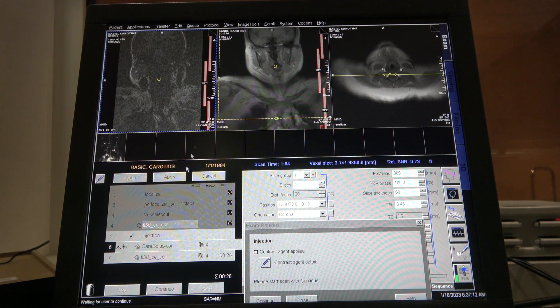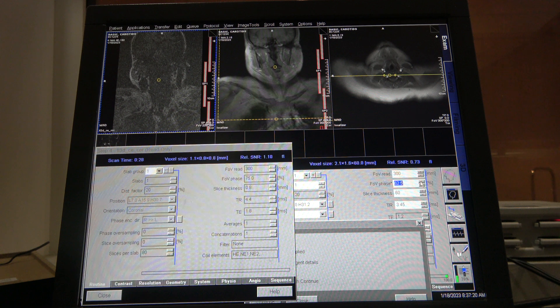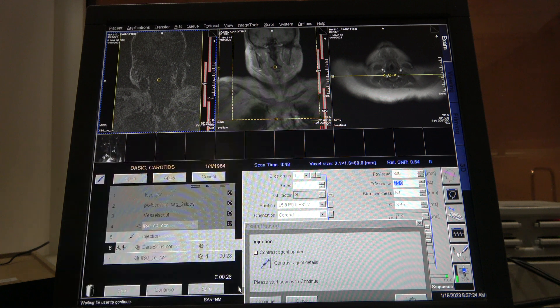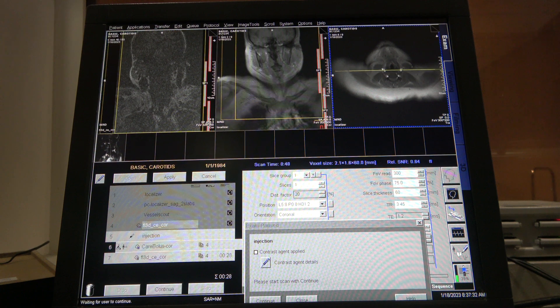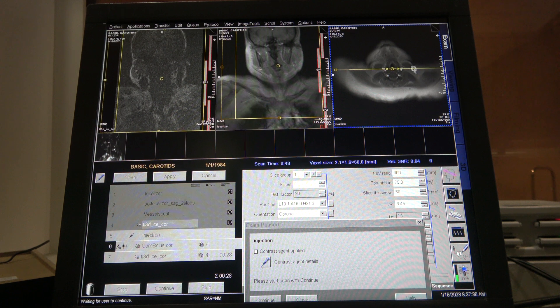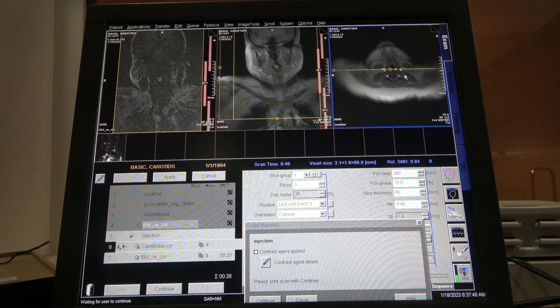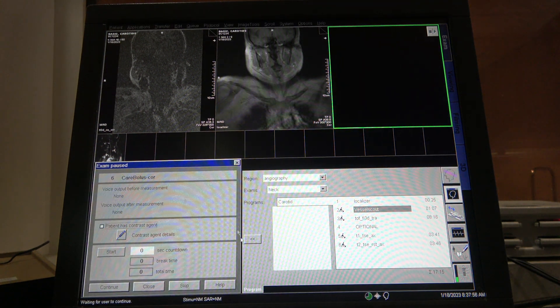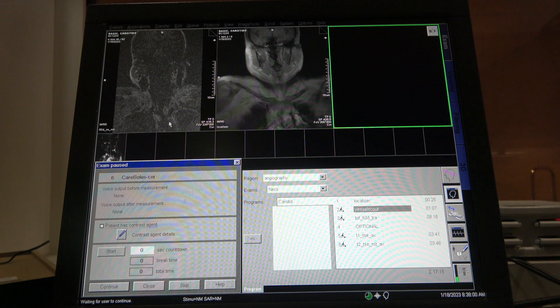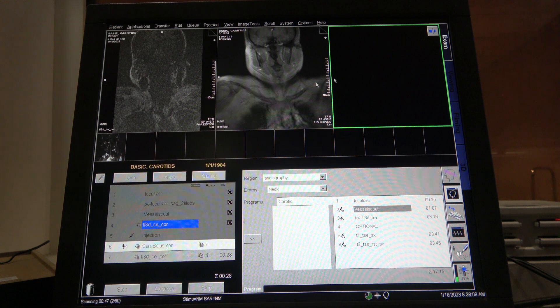You set it up again — it copied. We're going to change to 300, and this has 75 as well. This is going to be one thick slice. As you are injecting, this sequence here takes scans while you're injecting contrast. The goal is — when you start seeing contrast coming up from the arch to the carotids, that's when you want to start your scan. You'll see pictures here as contrast comes up.